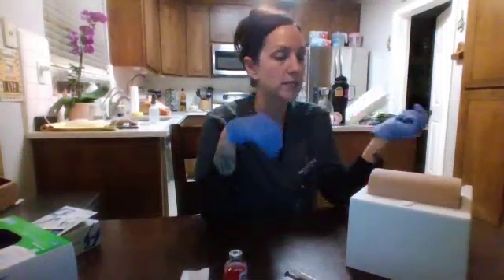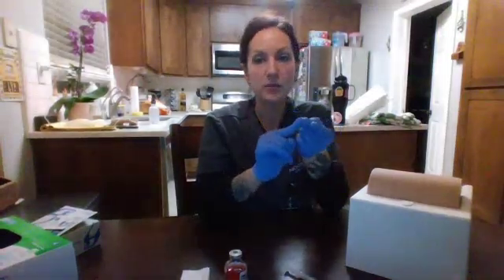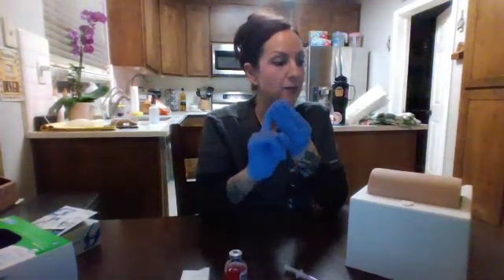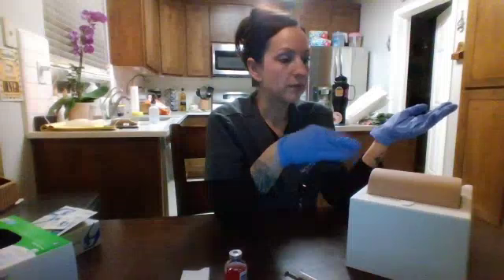Now I'm going to assess the site that I'm going to be using. So for subcutaneous injections, you can either use the outer aspect of the outer arm. You could use the abdomen from below the costal margin to the iliac crest, or you can use the anterior aspect of the thigh. I'm going to be using the abdominal site, 5 centimeters, either from the left or the right umbilicus. If that site is not available to use, then I would be using the anterior aspect of the thigh. I'm going to assess the skin for any bruising, inflammation, or edema, skin discoloration.